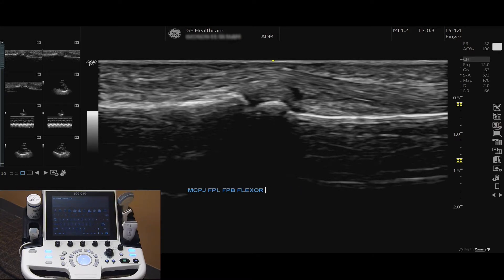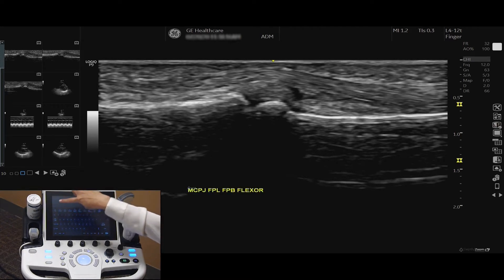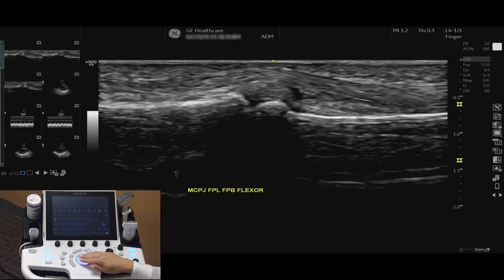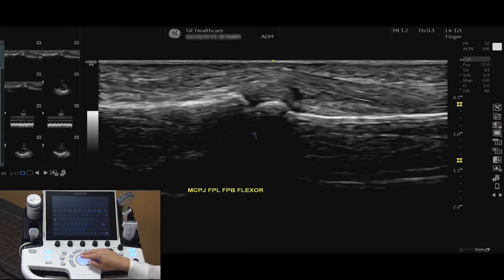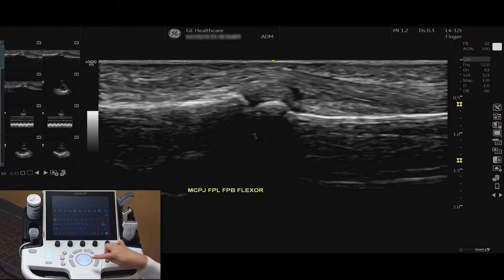You can add an arrow by selecting the arrow button. Use your trackball to move the arrow on your screen. To delete the arrow or comments, you can press and hold the Clear button.